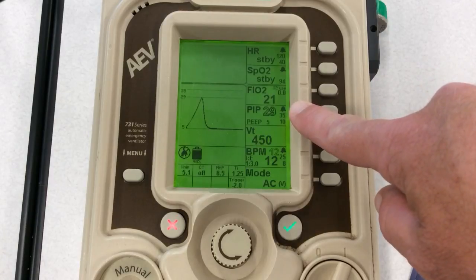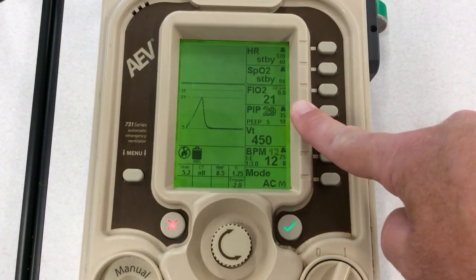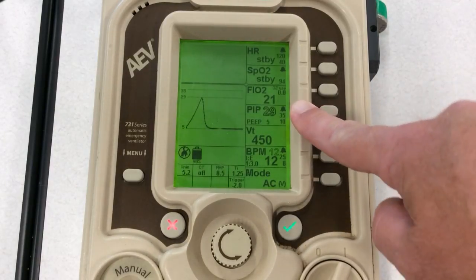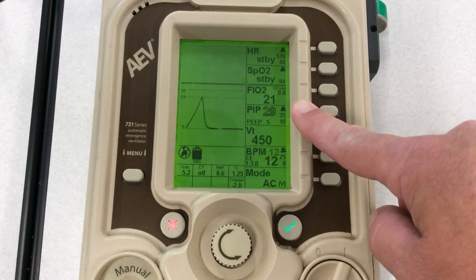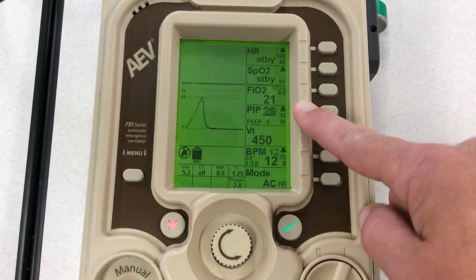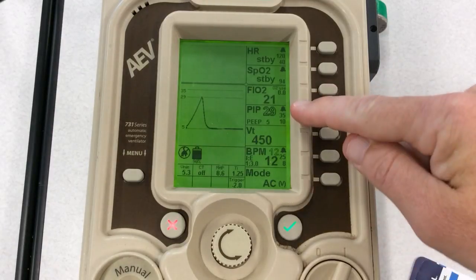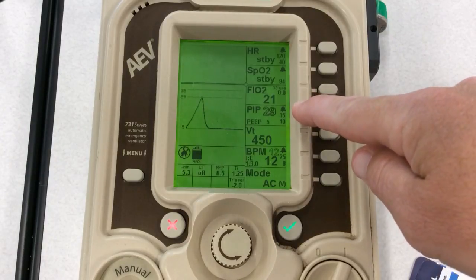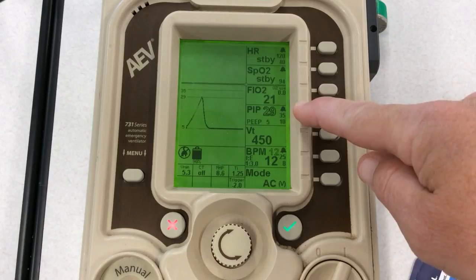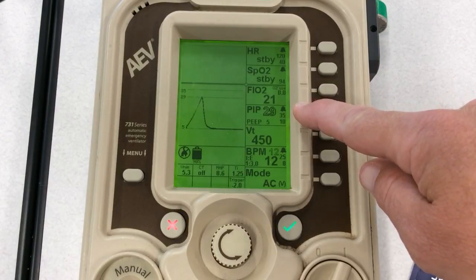I'm going to look at chest rise, listen to lung sounds, and listen to all the fields to make sure I've got good lung recruitment on both sides all the way to the bases, listening down on the lateral aspects of the thorax. I've got capnography in place, and I'm watching their chest rise. This is variable. My PIP could be anywhere from 15 or 20 all the way up to 30 or 35, and that's based on how much lung volume I think I need to get recruitment. Just watch your chest rise and listen with your stethoscope.